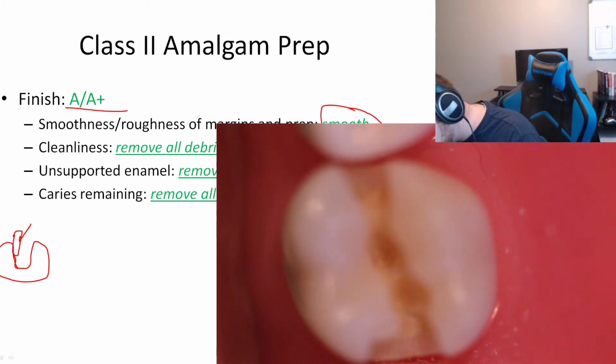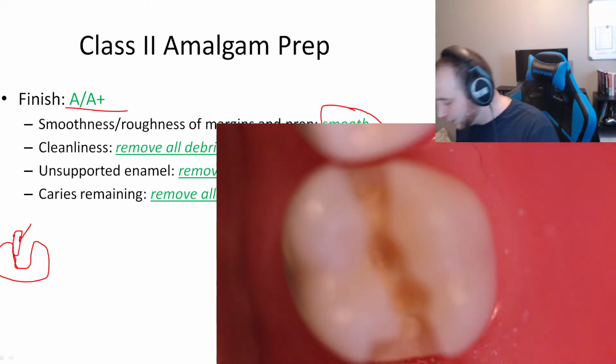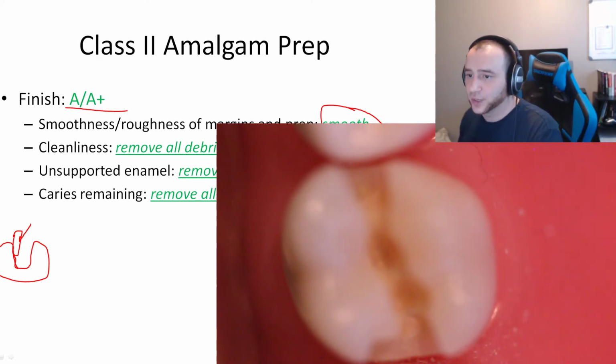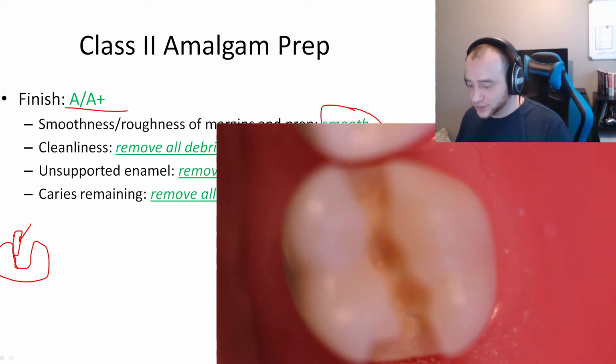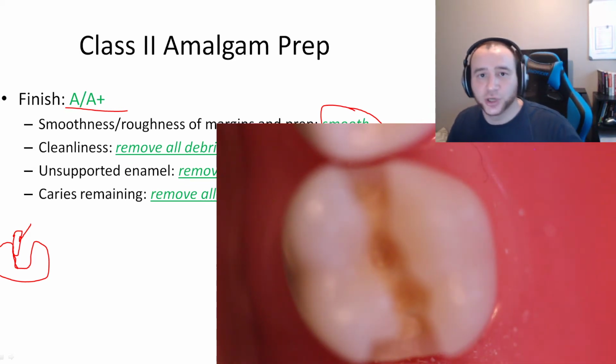Okay. And that's fine. You could start with that, okay? It's a good way to start. You're removing the majority of the caries. Now remember, this is how it should look once you're done your initial prep. Let me show you here. So once you're done your initial prep on a Kilgore tooth, okay?